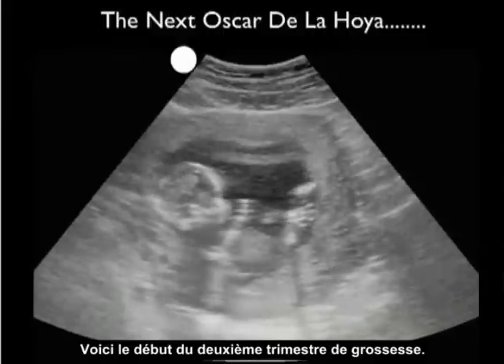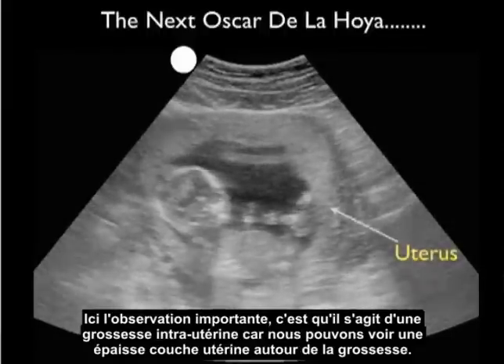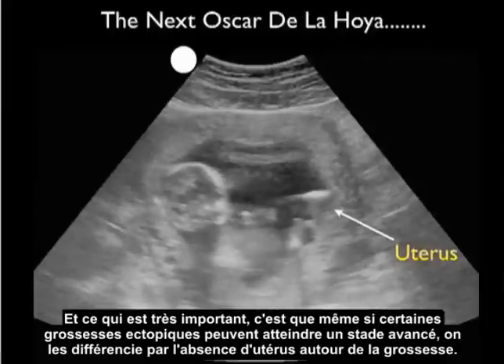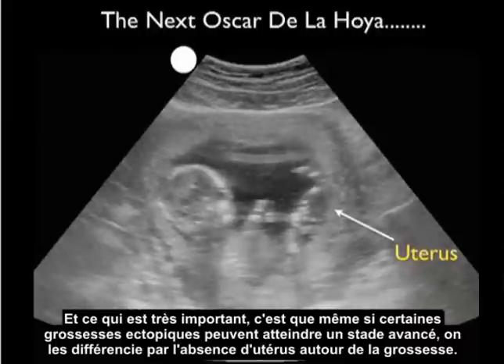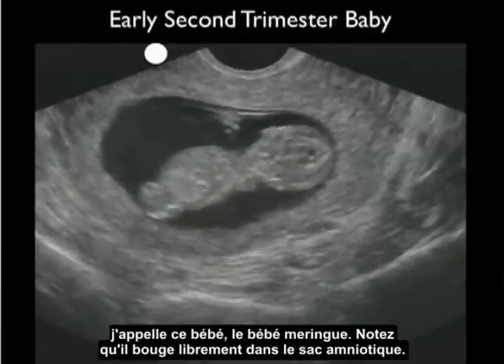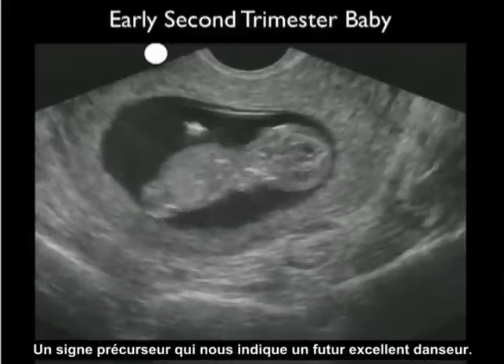Here's an early second trimester pregnancy — note the mean right hook on the baby. The important finding here is that this is an intrauterine pregnancy as we can define a good mantle of uterus surrounding it. That's very important as some ectopics can grow to an advanced age, but are discerned by a lack of uterus around the pregnancy. Here's another second trimester baby moving around fluidly within the amniotic sac.